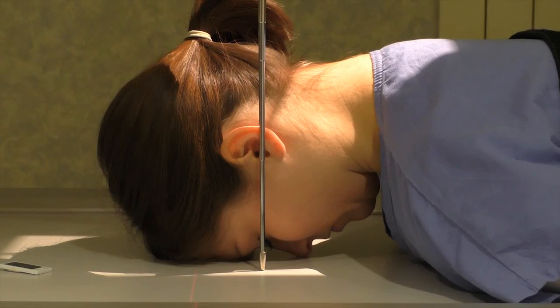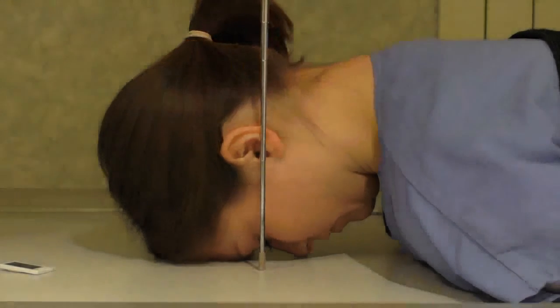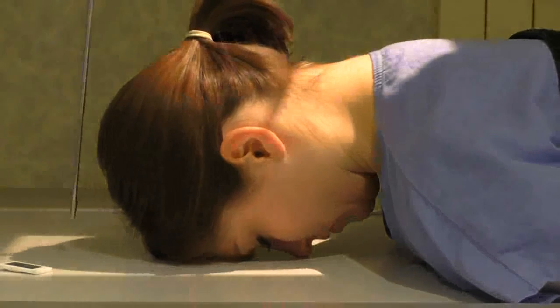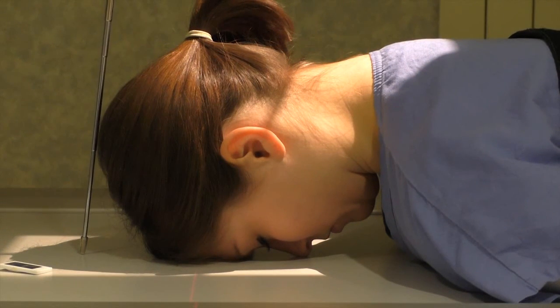For the Haas method, the patient is prone, nose and forehead against the table. There is a 25-degree cephalic tube angle to the OML. The OML is perpendicular to the IR. The mid-sagittal plane is perpendicular to the IR. Center at the EAM, so it exits 1.5 inches superior to the nasion. Collimate around the area of interest. Marker is placed on the correct anatomical side.